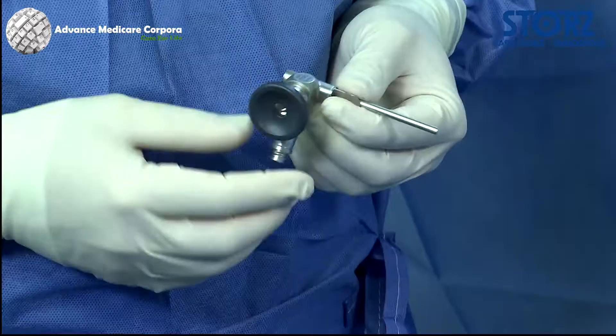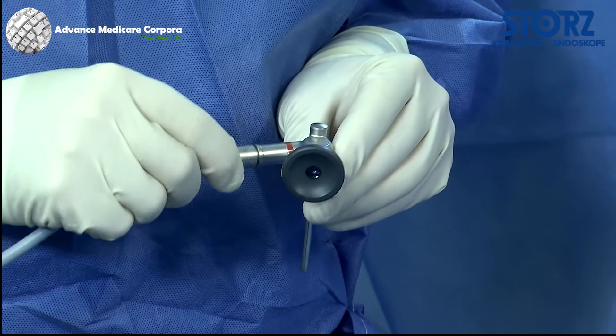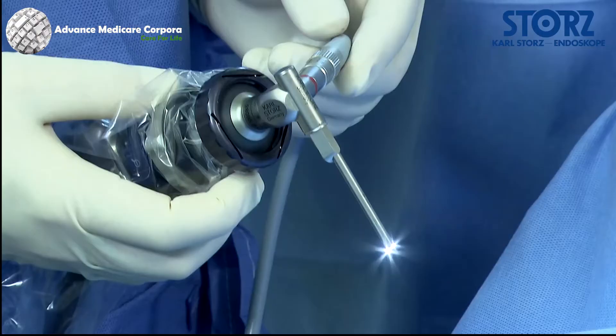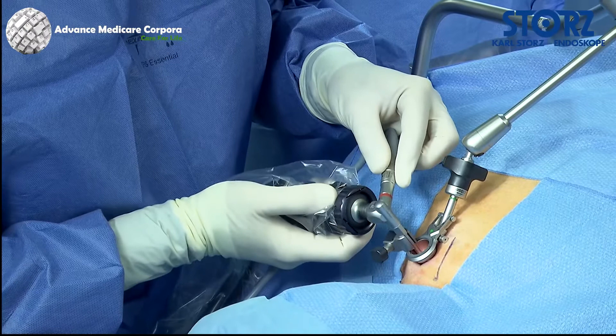Telescopes are available in three different lengths, and here a short telescope is required. The telescope is connected with the appropriate light cable and camera head. After white balance is carried out, the telescope is inserted into the holder and locked into position with a fixation screw.